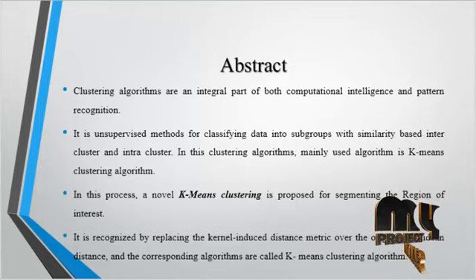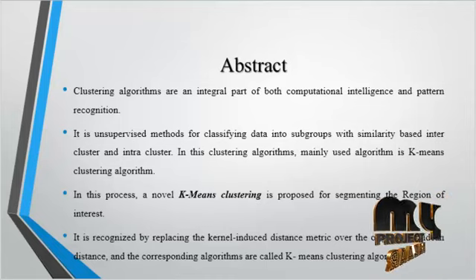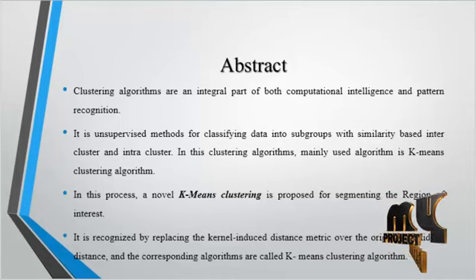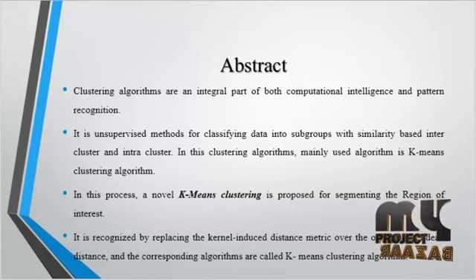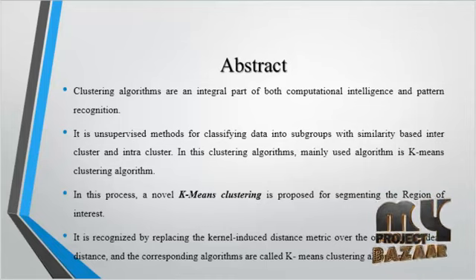Clustering algorithms are an integral part of both computational intelligence and pattern recognition systems. They are unsupervised as well as semi-supervised methods for classifying data into subgroups with similarity-based inter-clustering and intra-clustering methods. In clustering algorithms, the mainly used algorithm is the k-means clustering algorithm.